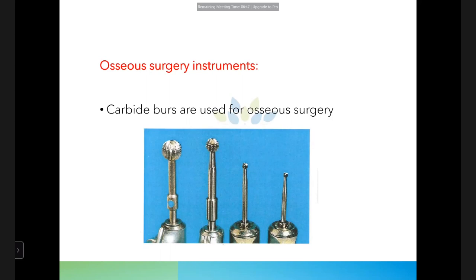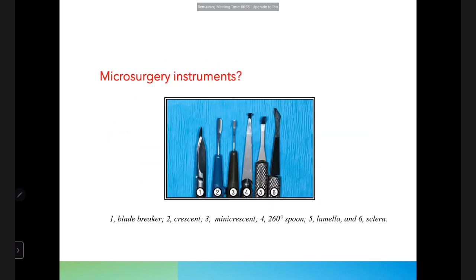For osseous surgery, in addition to surgical files, carbide burs can be used. These include different types of burs used for osteoplasty and ostectomy procedures.